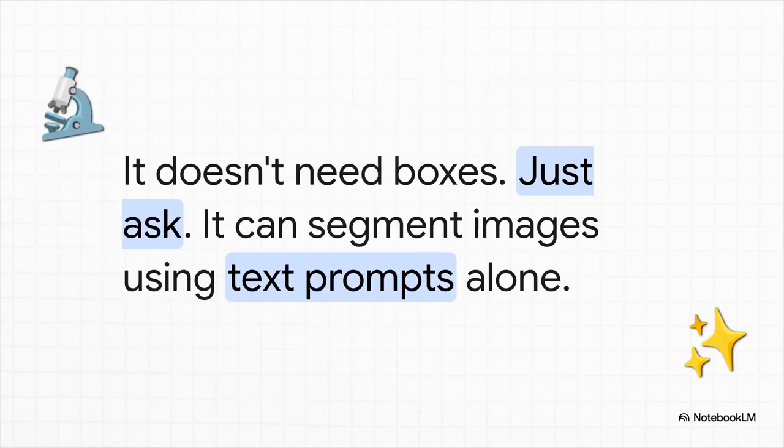And that brings us to the hero of our story today, a new model called BiomedParse. It just throws the whole idea of bounding boxes right out the window. Instead of drawing, a researcher can just type in a simple text prompt, something like, find all the inflammatory cells, and boom, the model does all the heavy lifting.